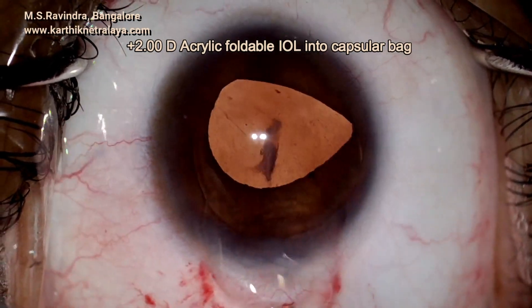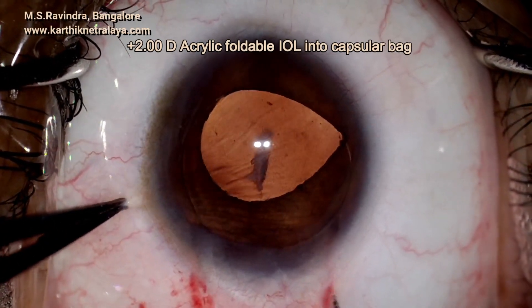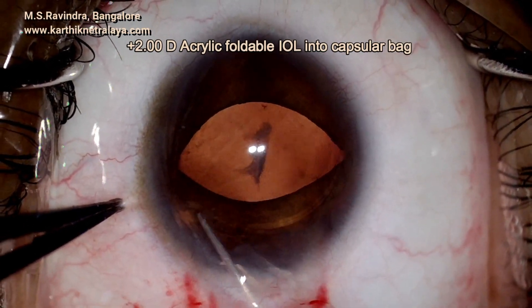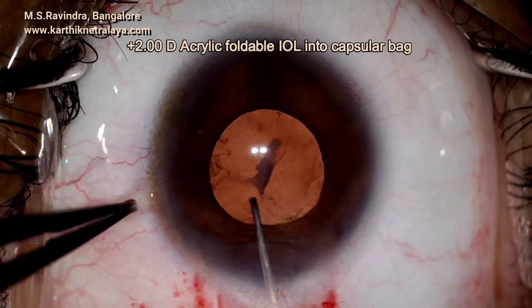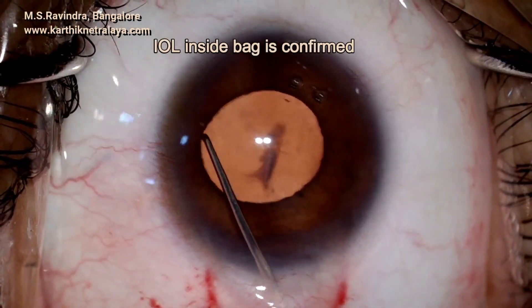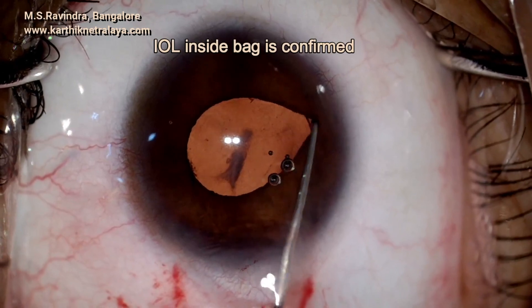Viscoelastic fills the anterior chamber and with the Sinskey hook the lens is positioned into the capsular bag. There is no stretch in the capsular bag as you can see. The capsular bag must have been of normal size. It is confirmed that the lens is within the capsular bag, and the HPMC is then irrigated and aspirated out of the anterior chamber and from the capsular bag.